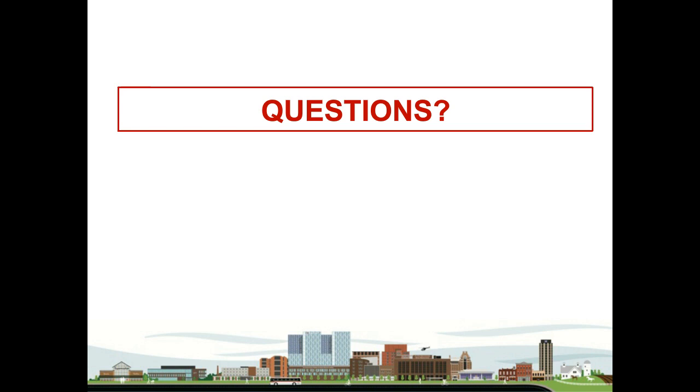From Baylor University Medical Center, does your facility allow capillary testing using earlobe? We occasionally get this request from physicians. Do you want me to try to answer that based on, for example, the intended use of a point-of-care glucose system? So I'll answer from a manufacturer's perspective: the only approved sample type is what is in the intended use in a package insert for the different point-of-care systems. So if somebody requests earlobe and it is not in the package insert, it means it wasn't approved by the FDA as an approved sample type. You'll end up in a situation where this is off-label use and people tend to shy away from it. So basically, as a manufacturer, it's following the intended use population and the sample types that are in the IFU or the package insert.